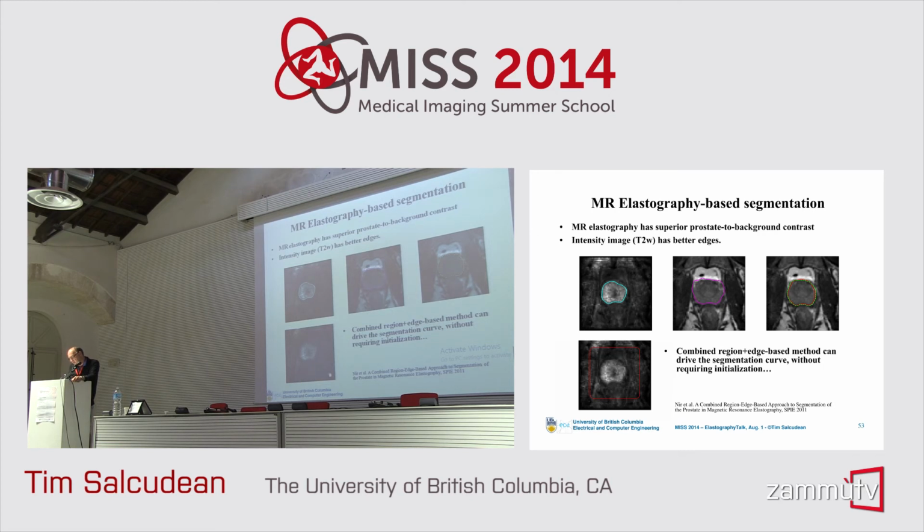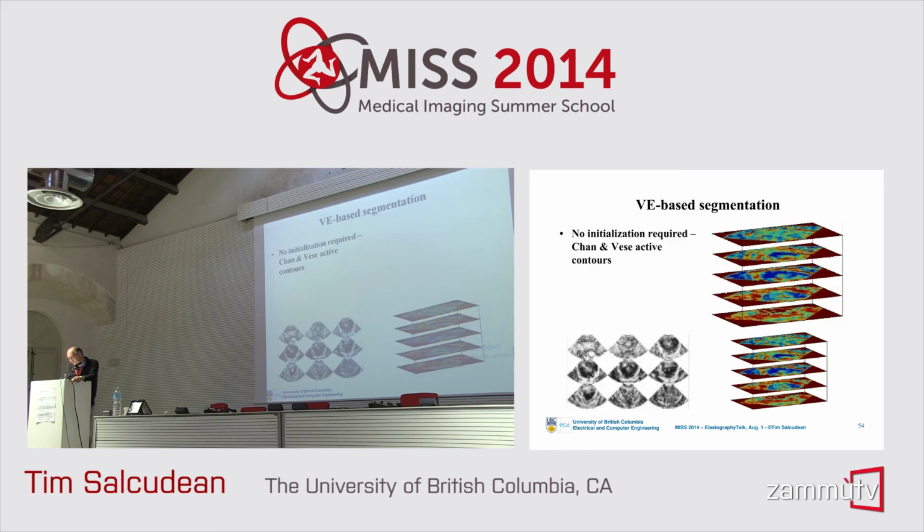I mentioned to you that you can do segmentation. Here's an MRE derived image of the prostate with a simple segmentation algorithm that doesn't require any type of initialization. Okay, that's again based on elastography. And here's a pretty lousy looking B-mode image that we have used with Chan-Vese to get again initialization-free segmentation of the prostate solely based on the elastography images.